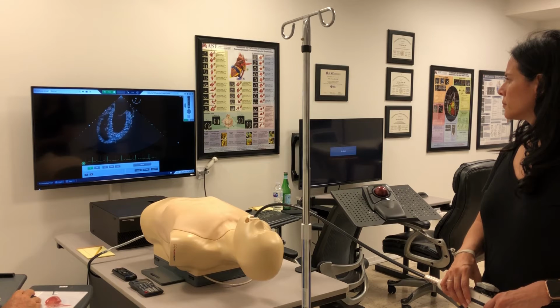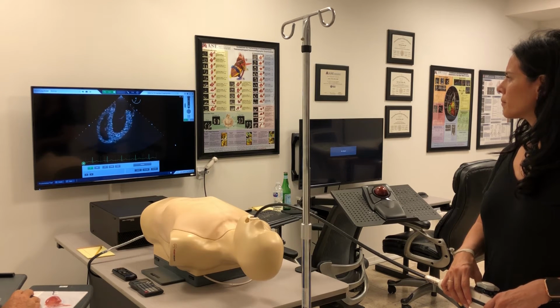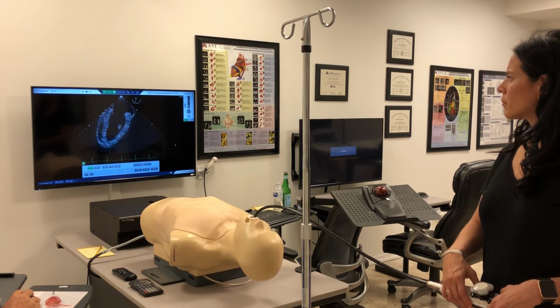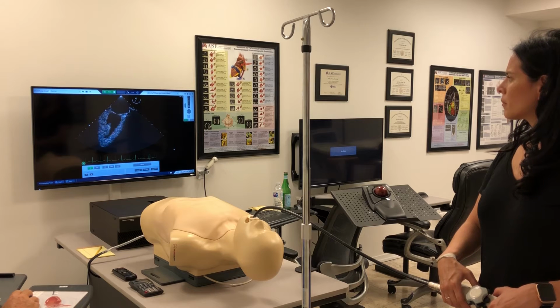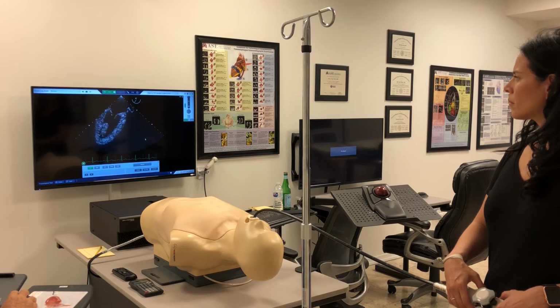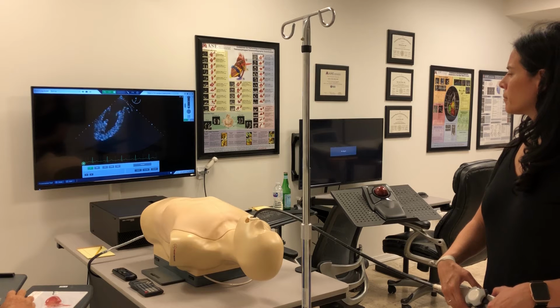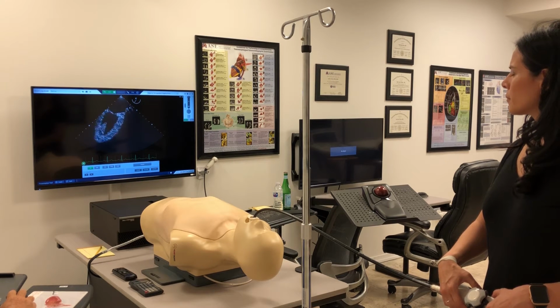Good. And remember that in this view, usually you'll see the Coumadin ridge in the left upper pulmonary vein. You won't have to go look for it. But if you do, remember that it's a little bit more dorsal. It's a little bit more posterior, so that'll involve a little bit of a left turn, counterclockwise turn, and you might have to withdraw the probe just a little bit. Try and really open it up with a little bit more turn. Good, that's nice. Maybe open it a little bit more. Good, perfect. And here's the Coumadin ridge right here, and above it will always be the left upper pulmonary vein.